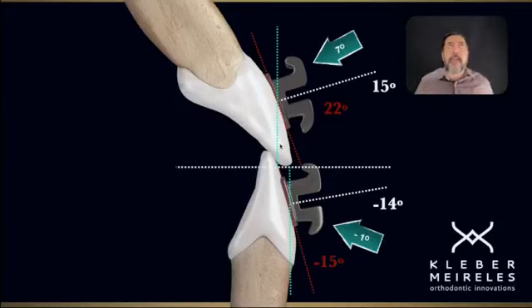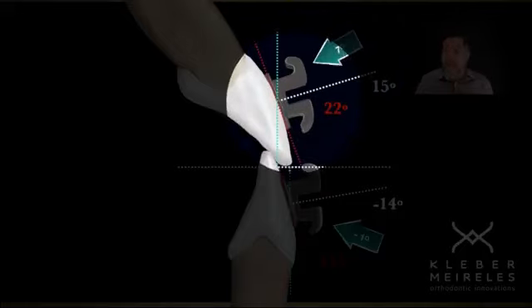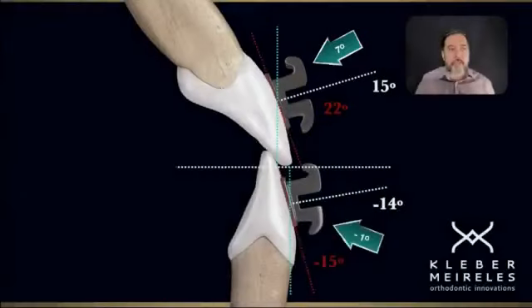And if we are thinking in absolute terms, not thinking about the play inside the slot, just for the sake of simplicity, let's say we have 22 degrees of inclination of upper teeth, and we have 7 degrees of inclination embedded in the slot. We have a difference of 15 degrees. Sometimes if we are inserting a thin rectangular arch wire, 16x25, 17x25, we won't change the inclination of an upper anterior tooth because we have the play inside the slot.